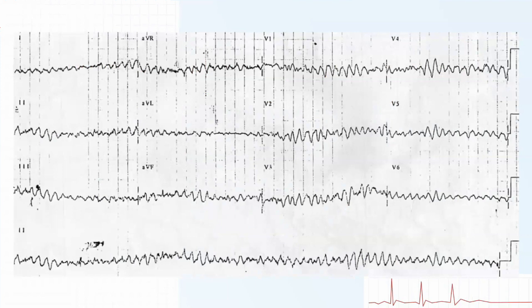This is an image that I got from the internet. So your VFib, ideally you should be seeing this either on your patient's monitor or on your defib machine. You don't want to be seeing this on a 12-lead ECG. It's a disorganized erratic ventricular rhythm. The waves are of different amplitudes and different morphologies.